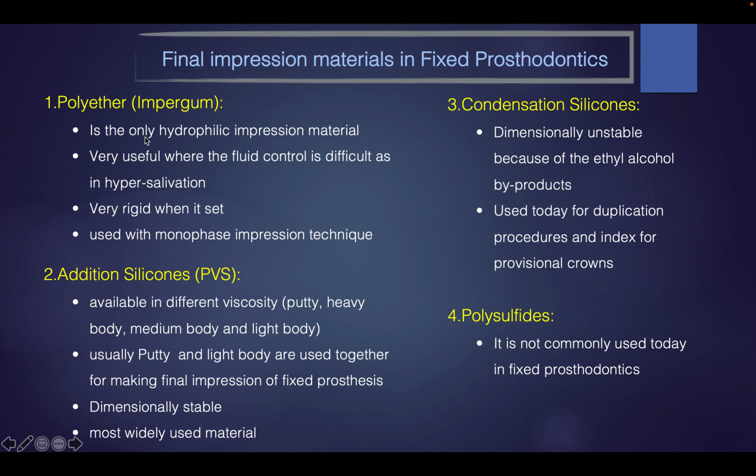Now, polyether, the newer ones, are slightly hydrophilic. They are more loving to water, so they have that slight advantage over addition silicone. But are they fully hydrophilic? No. So you still have to do the same. Everything has to be dry. So they are relatively hydrophilic.